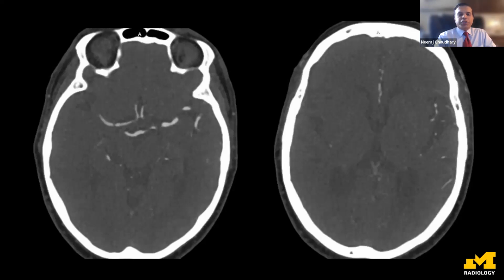So CT perfusion, or any type of perfusion assessment of a core and penumbra, is done only when the patients present beyond 4.5 hours. So they don't have, or they're contraindicated to have, intravenously administered tissue plasminogen activator, TPA as we know it. And we see here on the right side, paucity of perfusion of the left cerebral hemisphere, completely asymmetric compared to the right side.